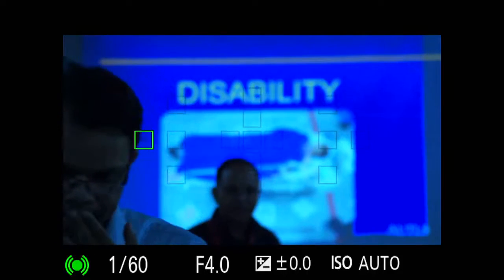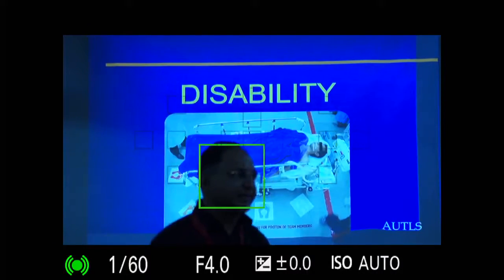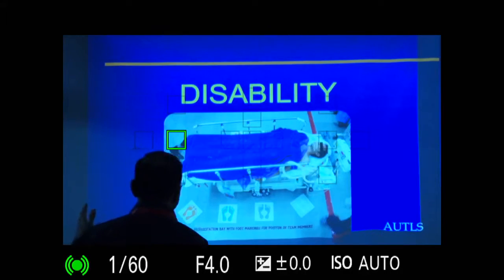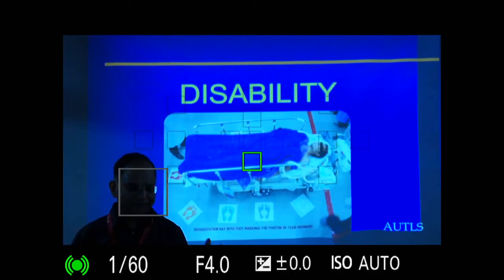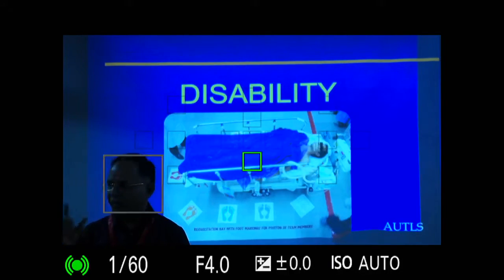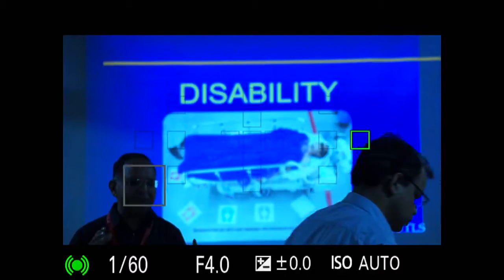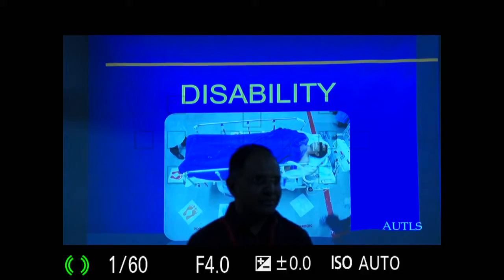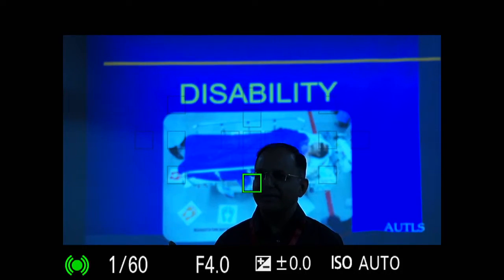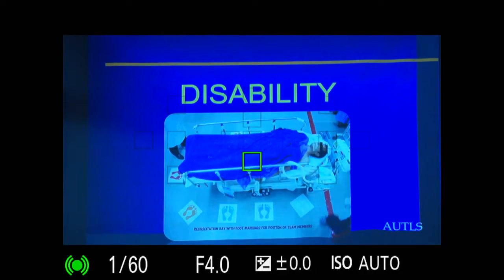We come to another important aspect of ultrasound, and that is in the D part. Now we have talked about A, we have talked about B, and C, and now we come to D. More important is what we commonly do. Any patient with suspected head injury, we rush to see the GCS. That should never be done. Only after ABC should we go on to D, and I will illustrate with an example.